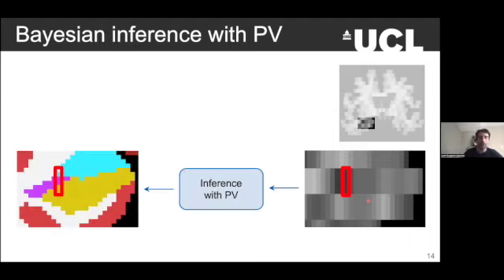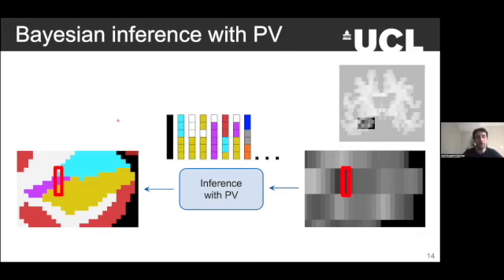And the reason is that if you think of this French fry that you have here, this thick slice, at 1 millimeter isotropic, this is the average of, for example, 4 or 5 voxels like this. And when you think about how this segmentation generated this image, you have to consider all the possible internal configurations of sub-voxels of this super voxel that gave rise to my French fry. And so that quickly becomes computationally intractable. You can write it down, but it would take the age of the universe. My former supervisor, Koen Van Leemput, has a paper on this, and he makes all these approximations, but I don't think anybody has gotten this to work in practice in reasonable times.